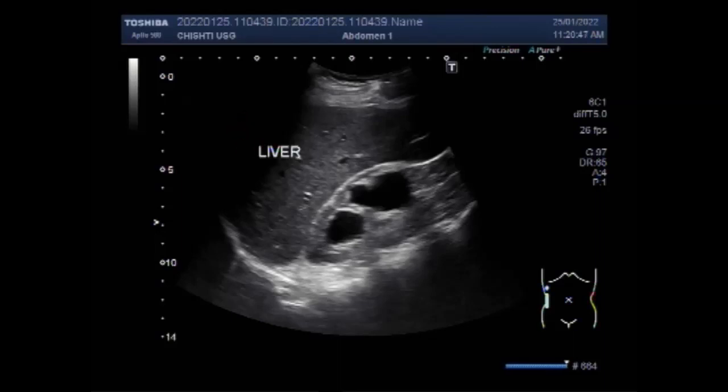This is the liver. This is the right kidney. The patient is aged about 22 years, a male patient.